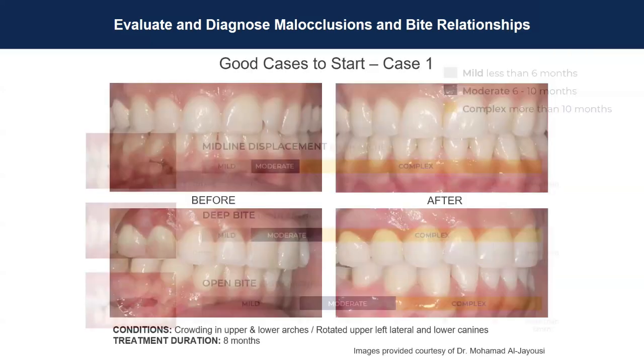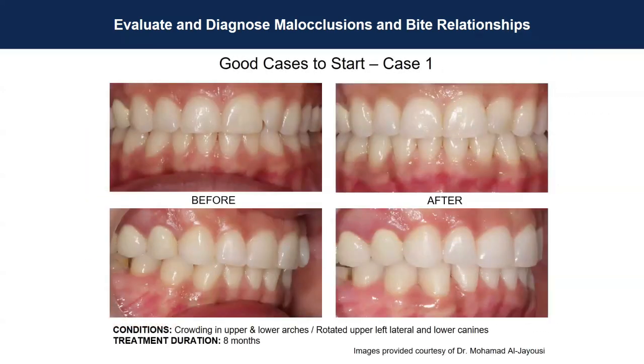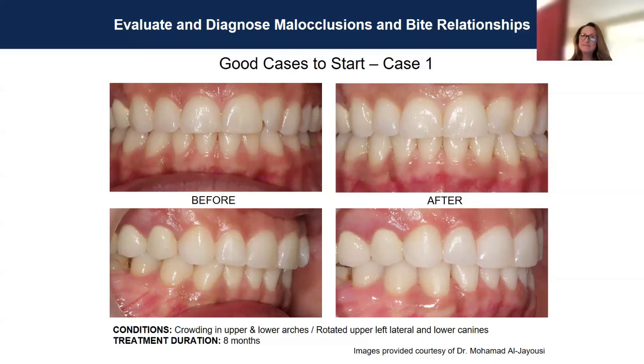We do have one, but this might fall under your disclosure of not being a doctor, not being able to diagnose, so I'm going to preface that before I read it. An attendee states that they are 78, with no perio pockets, some horizontal bone loss, and posterior black triangles. They're asking if they can use aligners to close the spaces between their teeth. The food traps are driving them crazy.